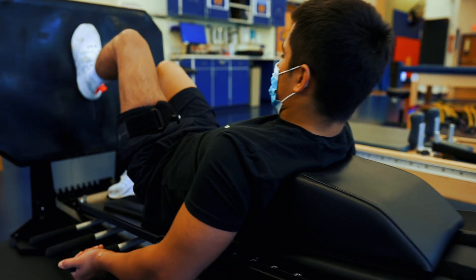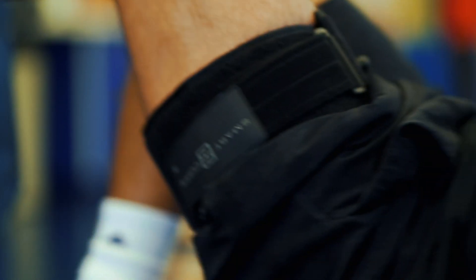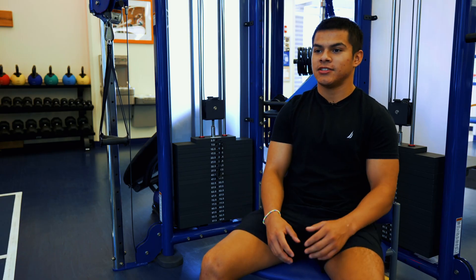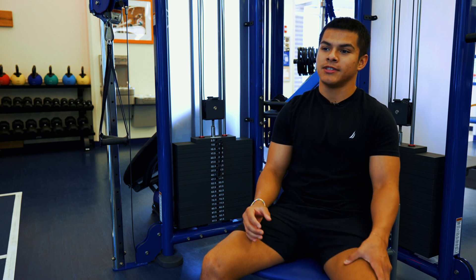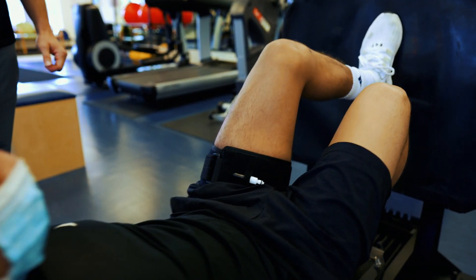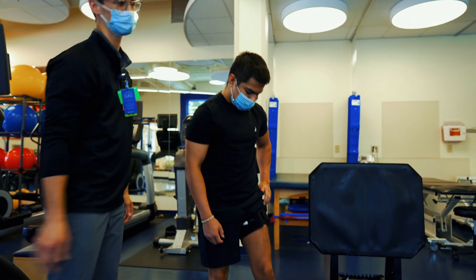BFR mostly feels like pressure at first — just like a tight band around your quads. As you start exerting yourself and doing exercises, you feel your leg get more and more fatigued, which is a good feeling because it helps with the mind-muscle connection. Post-op, you don't really know what your leg feels like anymore — how to feel it, how to flex it — and the BFR stimulates that feeling.